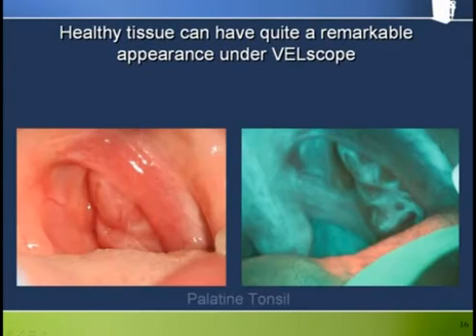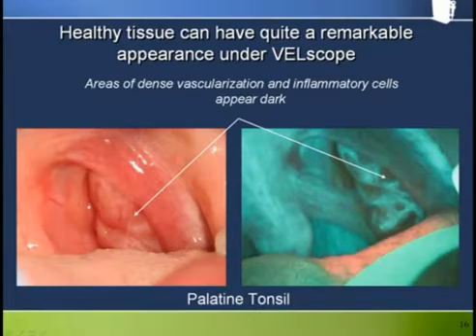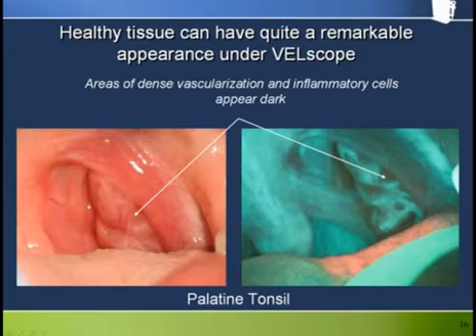Some structures in the mouth have quite a remarkable appearance under Velscope. A good example is the palatine tonsil — the areas of dense vascularization and inflammatory cells appear quite dark. Again evident in these pictures is the darkened anterior tonsillar pillar.